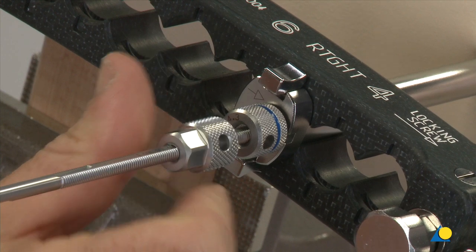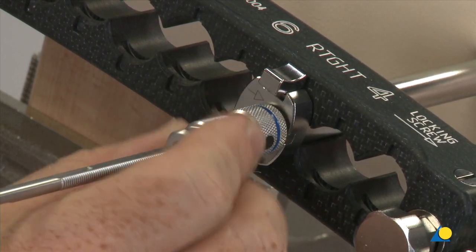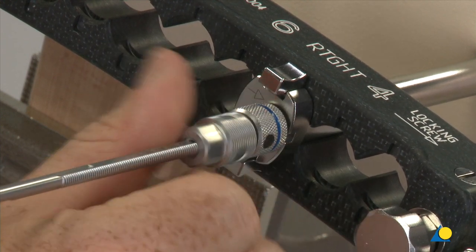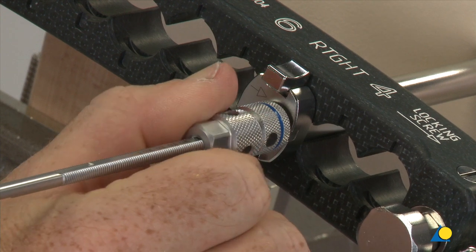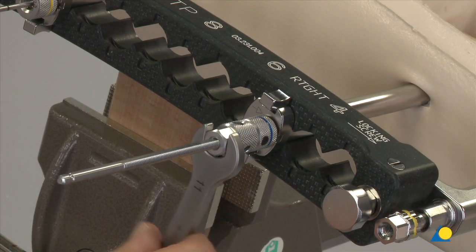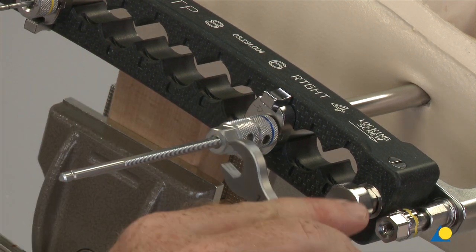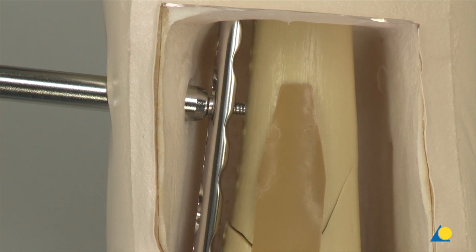Remove the power tool and begin tightening the nut toward the drill guide, first by hand and then with the 11 mm combination wrench. Monitor the progress of the reduction of the bone to the plate under image intensification, and check the final reduction again.